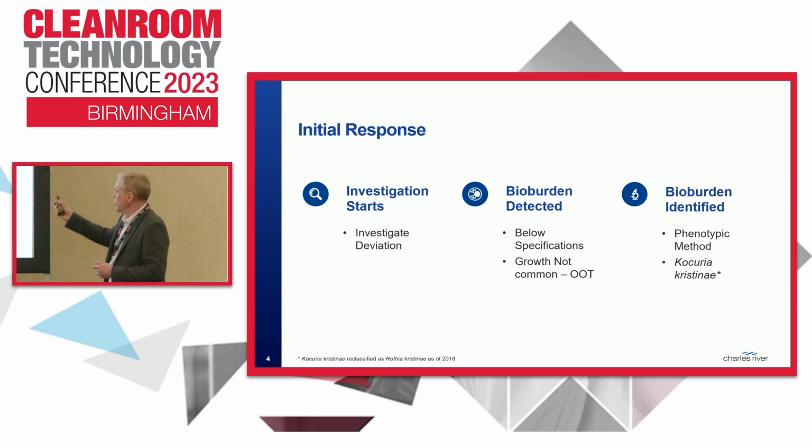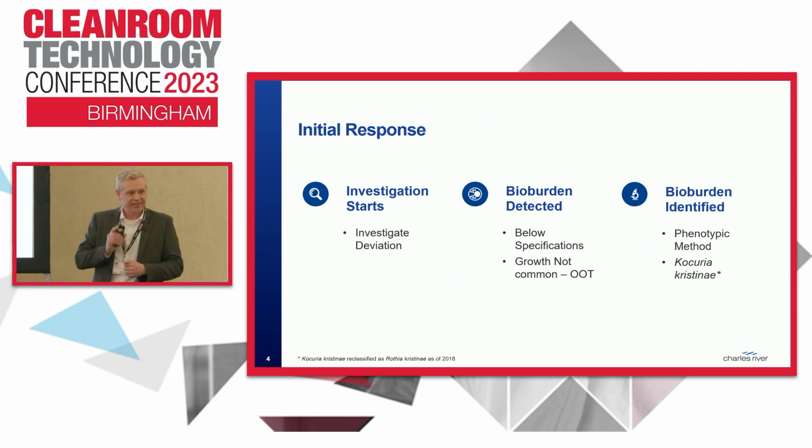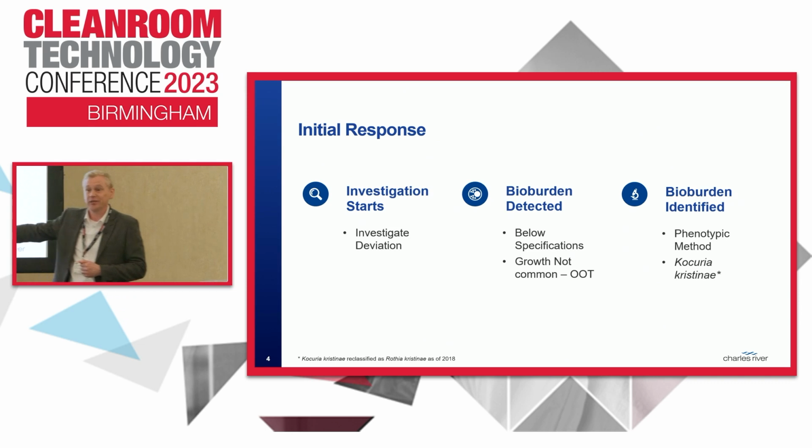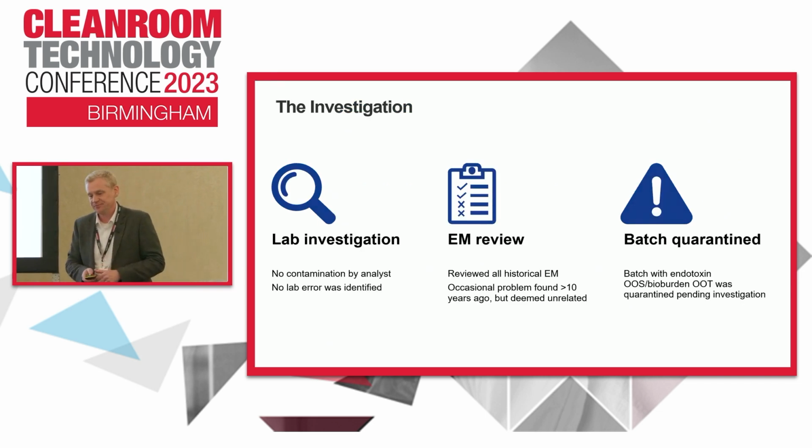I'd just like to point out, the identified organism is Kocuria kristinae, but bacterial taxonomists like to make things difficult for people, so that species was actually reclassified to a completely different genus back in 2018. So you have to be aware that things may change their name as well when you look at names.